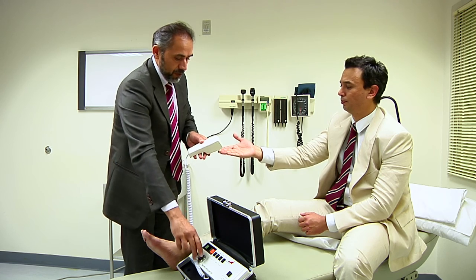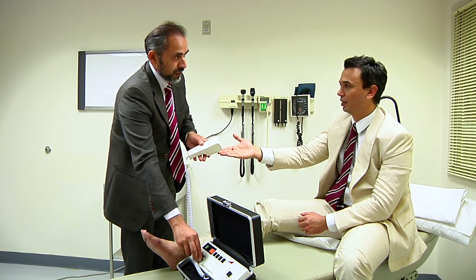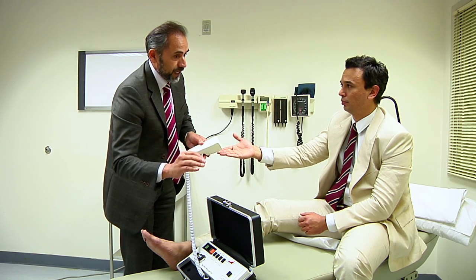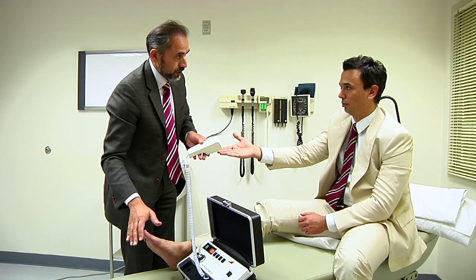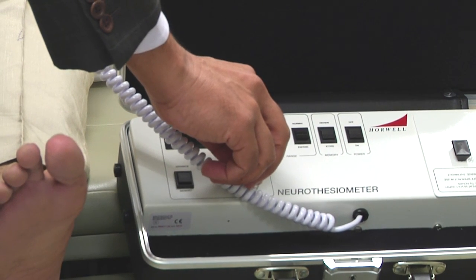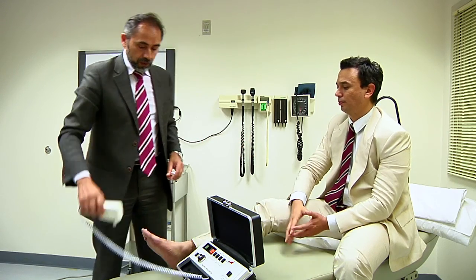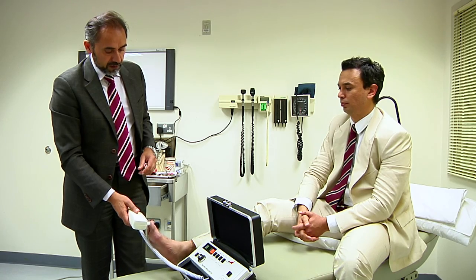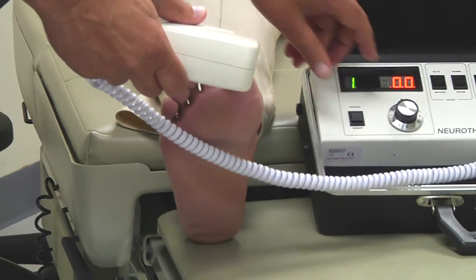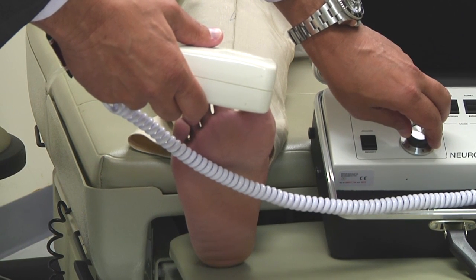Yeah. But now you'll feel a buzzing sensation. Yeah. You feel that? So what I want you to do is wait until I touch the instrument on your toe, but as soon as you feel the buzzing sensation, you let me know. Sure. Okay, so we're going to do that now. I'm just going to place it on the end of your toe, and I want you to close your eyes, okay? All right. And you tell me when you first feel the buzzing sensation. I can feel it now.